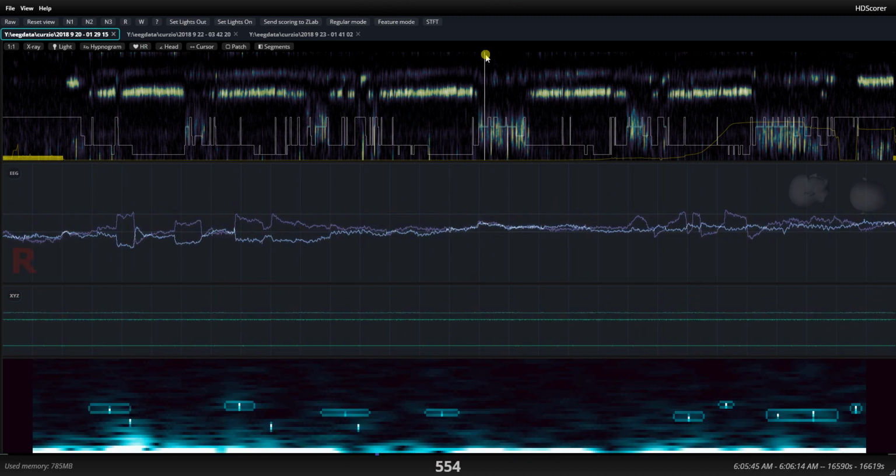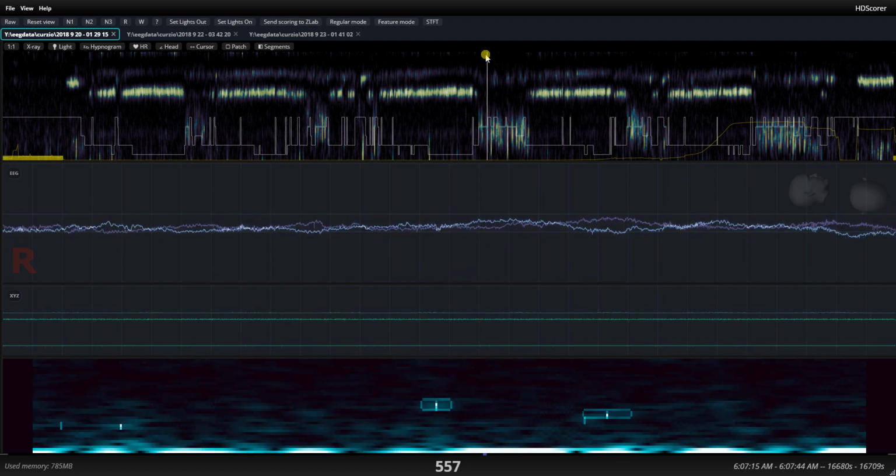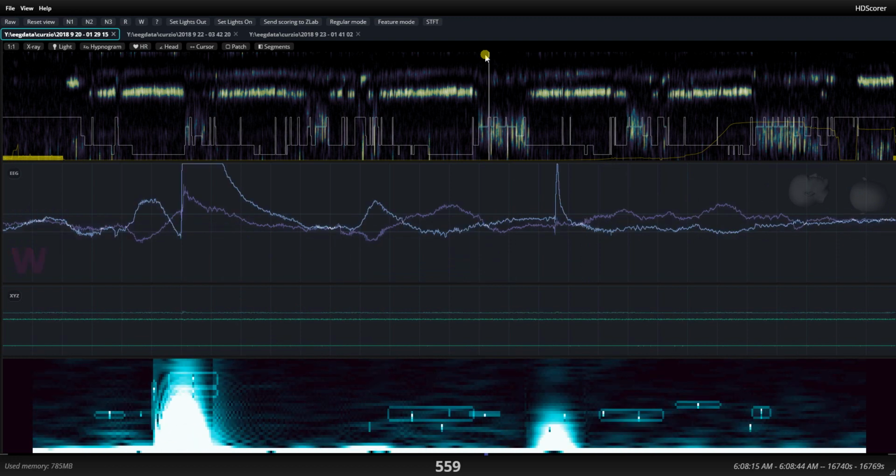Then what I would want to see is why there are these interruptions in the middle of REM. There's some wake. Let's see what that's about. It seems to me that here we got some electrode problems, because why is there that kind of a spike?